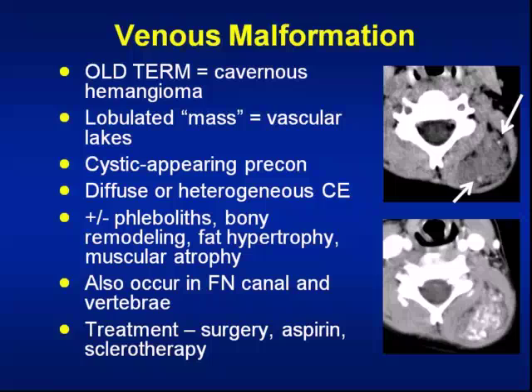It's a venous malformation. We now have histologic proof that these are GLUT1 negative lesions, so the geniculate ganglion lesions should no longer be termed hemangiomas, just like the vertebral body lesions should not be called vertebral body hemangiomas anymore because they're venous malformations. So what do you tell the clinicians? I usually put in my report, consistent with a vertebral body venous malformation, parentheses, formerly known as "hemangioma," and I put it in quotes so that we're all trying to speak the same language if the clinicians aren't used to seeing venous malformation in the vertebral body.